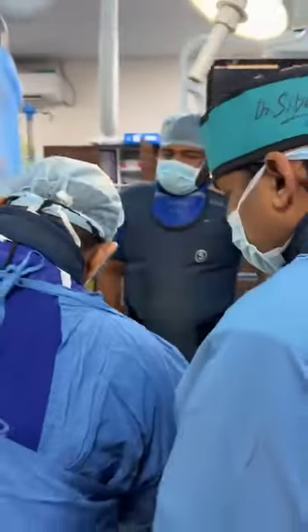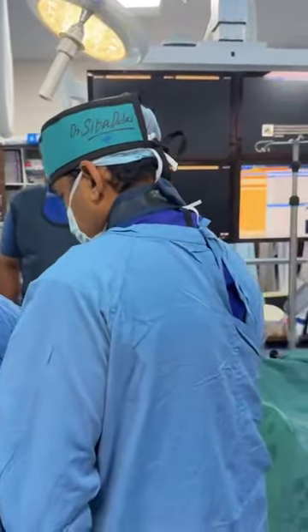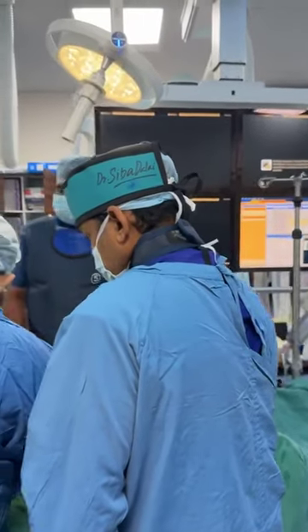So we have exposed the right femoral artery. Needle. Which is a little deep.